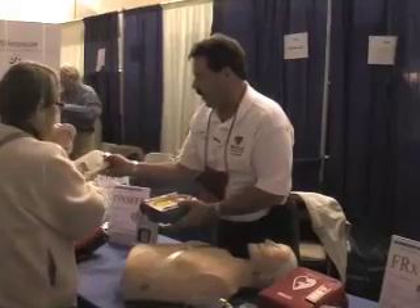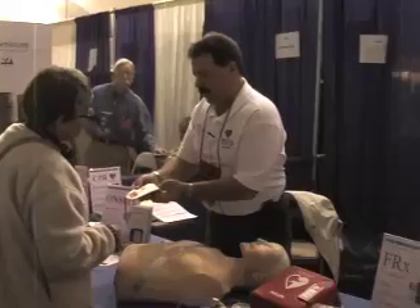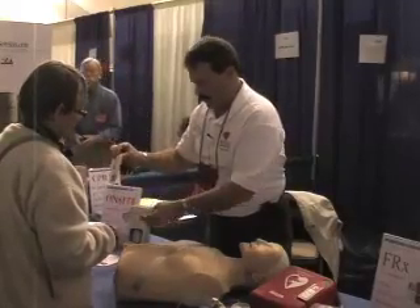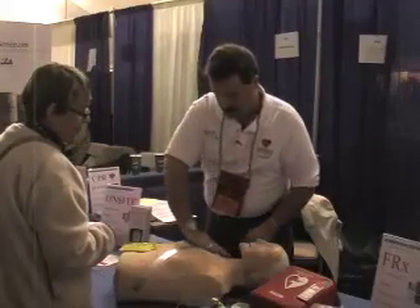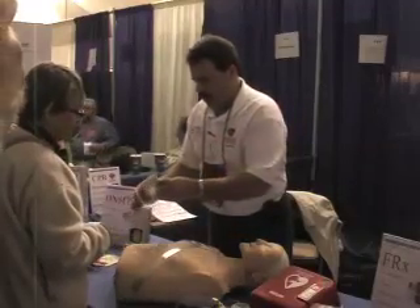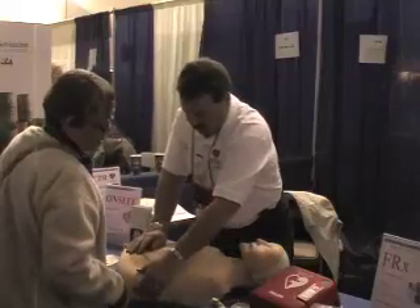See the pad there? It shows you where that one goes. And that one shows you where that one goes. So you peel this one off, you place it right here up on the shoulder and press it firmly. The other one goes down here on the side — press it firmly.